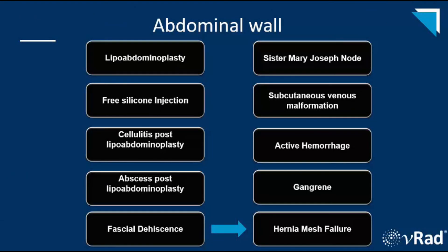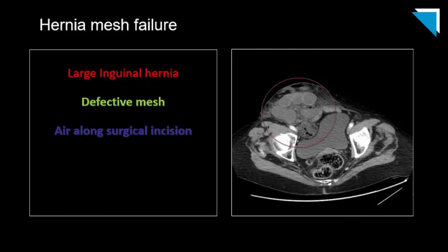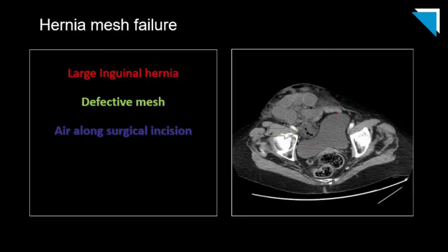Our last case is a hernia mesh failure. This patient underwent right inguinal hernia repair with mesh two days ago. We see a large right inguinal hernia containing fluid-filled small bowel loops, compatible with recurrent inguinal hernia, incarceration, and a closed loop small bowel obstruction with mesenteric congestion of the herniated bowel loop. The ill-defined air-containing structure at the neck of the hernia represents the crumpled hernia mesh with scattered foci of intraoperatively induced air; however, no abscess was found intraoperatively.